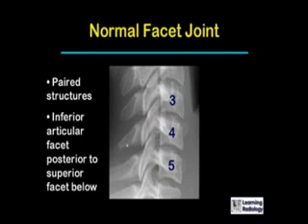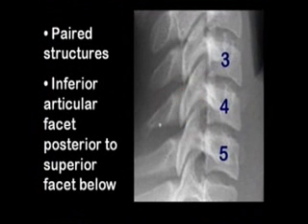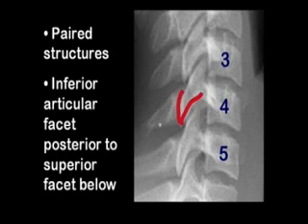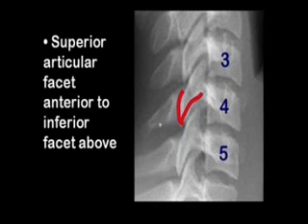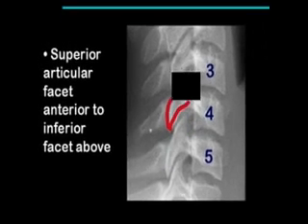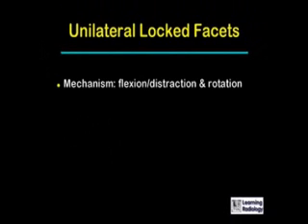The facets are paired structures. The blinking red line is pointing to the inferior articular facet of C4, which is posterior to the superior articular facet of the vertebral body below it, indicated by the blinking blue line. The superior articular facet of C5 lies anterior to the inferior articular facet above — that is the normal relationship of the inferior and superior articulating facets.